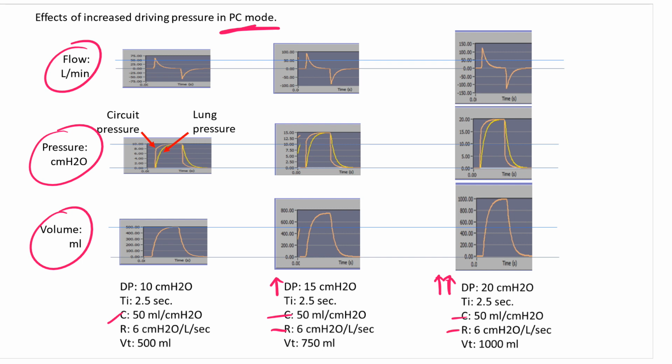All right, so as we increased the driving pressure, we noted that, of course, with the compliance being the same, when we induce more pressures, we're going to get larger tidal volumes as we increase those. We'd expect that. What I also wanted to demonstrate, more importantly, is that we have this increase in peak inspiratory flow.